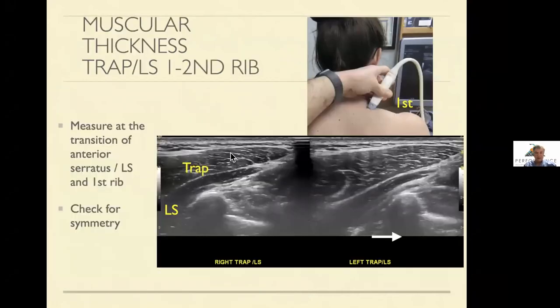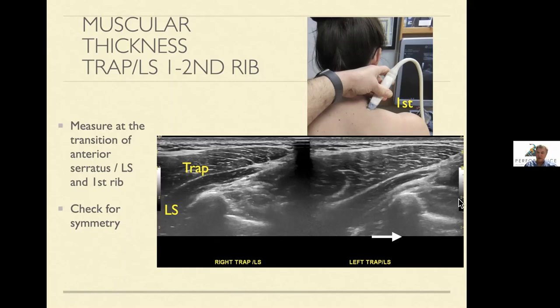Looking at the superficial view: this is anterior, this is posterior, this is trapezius, and this is levator scap coming in under here. The spinal accessory nerve comes in this fascial plane, and the dorsal scapula nerve will come down in this other fascial plane — that's dorsal scap right there. As you slide laterally, serratus anterior will emerge under here. There's also a small attachment of the posterior scalene onto the second rib underneath the serratus anterior, which we're not covering today. But this relationship — trapezius, levator scap, and serratus anterior as you slide laterally — is really important.